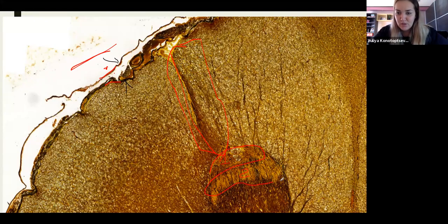If you compare the two laminas, you can see that lamina 2 does not impregnate whatsoever. It's almost nothing there. Why is that? Because here we have almost no myelin. Lamina 2 is this jelly substance. You remember we call it substantia gelatinosa. It's basically like a jelly, and this jelly is a little bit free of myelin. As a result, it does not impregnate very well. What was the job of substantia gelatinosa? What was it doing?